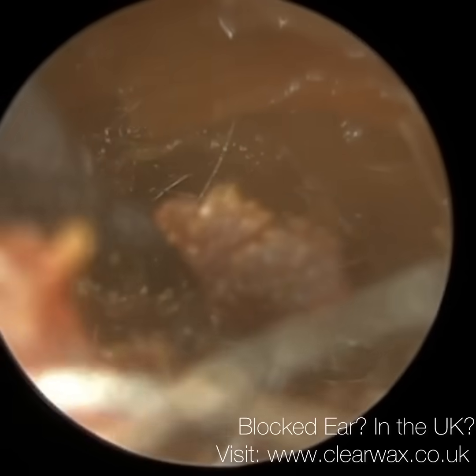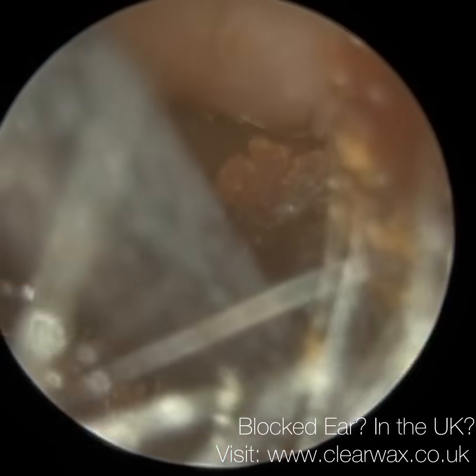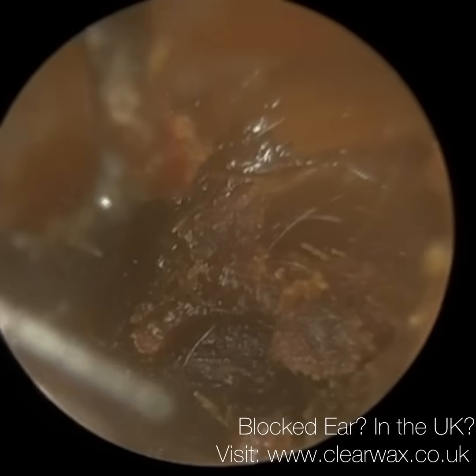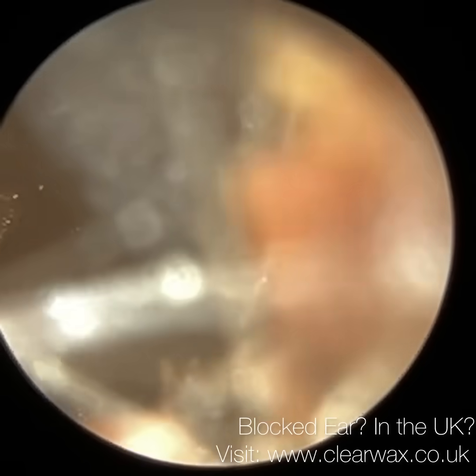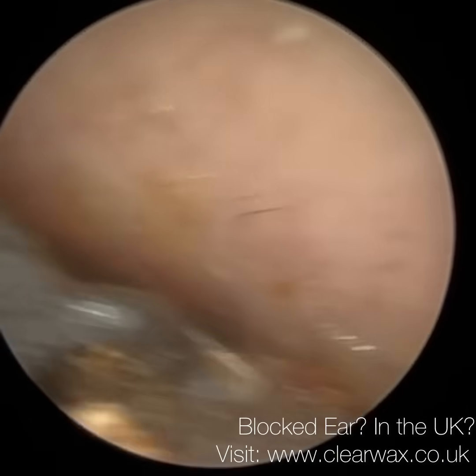So I know some people, well, none of us like the hairs there, in terms of when you're viewing, they can protrude the way. So in the past, I've tried to trim with different varying levels of success, and I occasionally have to pluck them. I think plucking them sometimes is more effective, but if they're not causing me a problem, I tend to leave them.